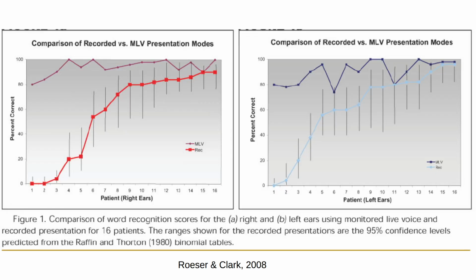What this is showing us is that monitored live voice word recognition is much less sensitive to differences between patients' ears than recorded materials. So if we want to see differences between patients in terms of their performance, we will see much greater sensitivity by using recorded materials rather than monitored live voice materials. Monitored live voice materials are relatively insensitive to differences across ears or across patients.